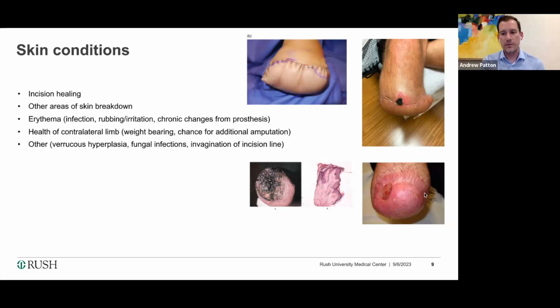So this person, unfortunately, is a double whammy and really needs a lot of adjustment to their socket. Honestly, this person probably needs to stop wearing their prosthesis for a couple of months, have really close wound care follow-up, and start wearing their shrinker, which we'll get into in a little bit, to start reforming the shape of this. But this person clearly was in an ill-fitting prosthesis and didn't have proper wound care leading up to this.